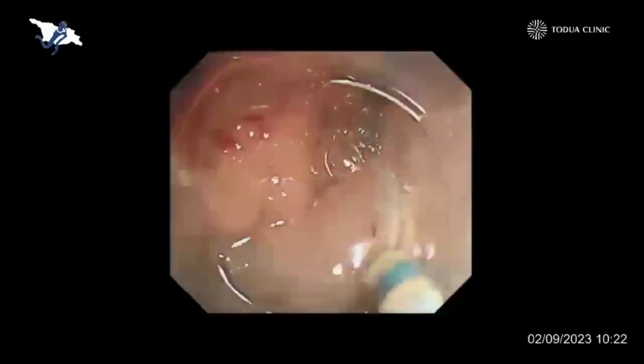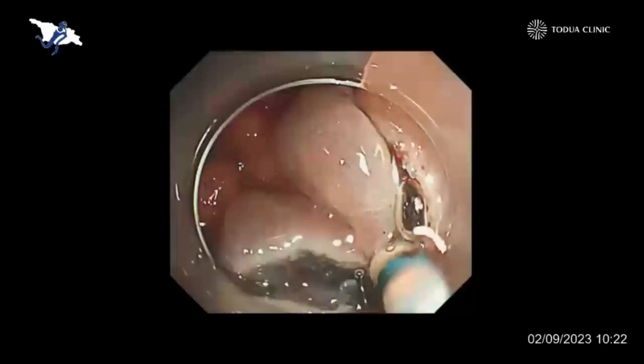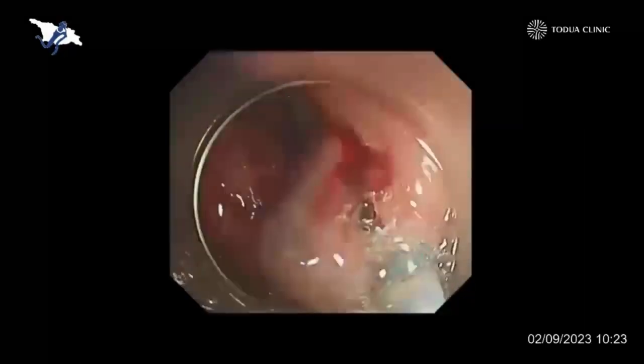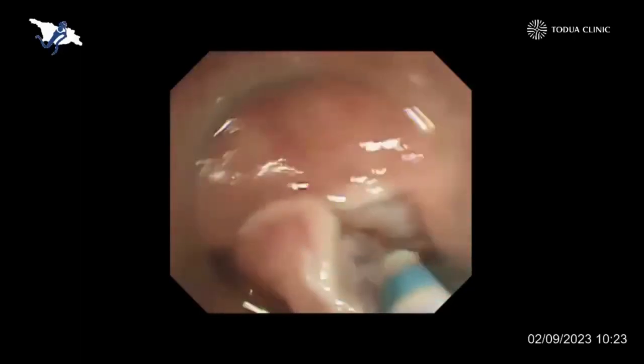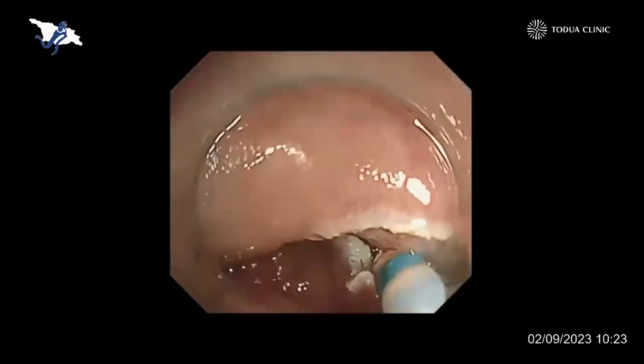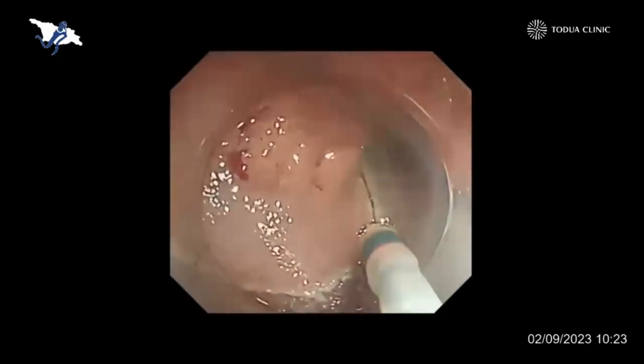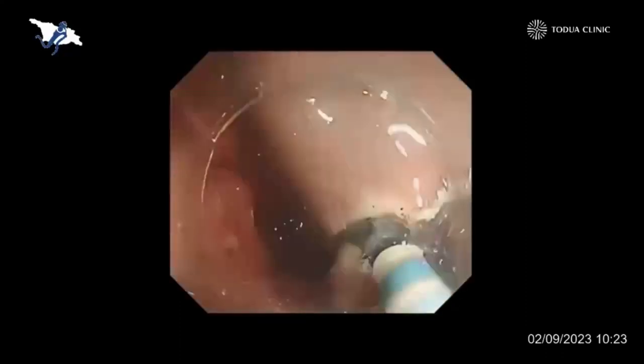Now I'm conducting mucosal incision from the anal side in a straight position. Again, I injected a large amount of solution into the submucosal layer to lift up the target lesion from the muscle layer, and carefully made initial mucosal incision using dry cut. Then I quickly started the submucosal dissection using swift coag. Swift coag is very powerful and can coagulate blood vessels, so it usually doesn't cause any bleeding during submucosal dissection if we dissect very carefully. Now I'm extending mucosal incision to the lateral side, then quickly starting submucosal dissection by tracing the inner edge of the incised area using swift coagulation at BIOS-3 setting.